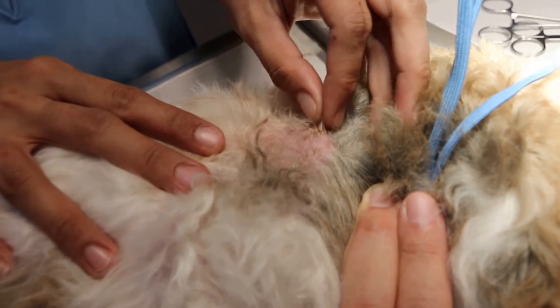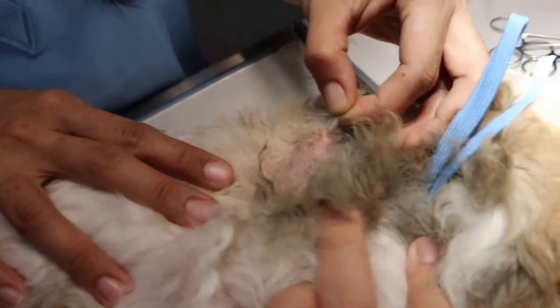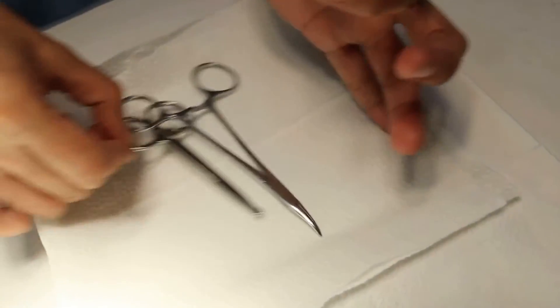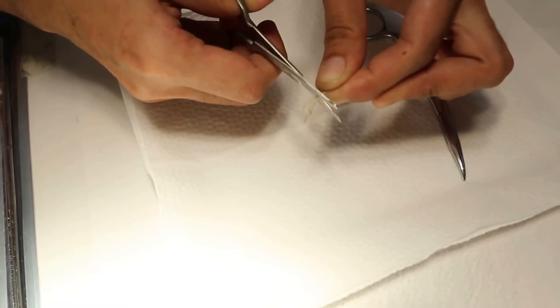By pulling the hair on the periphery of the ring, about 2cm, and then cutting it using the scissors — cut the lower end, about 2cm.